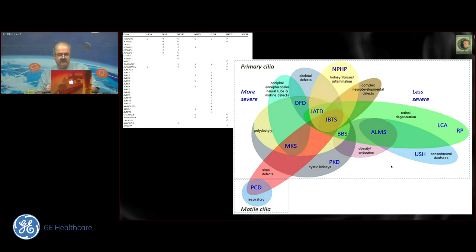Okay, a few more questions before we close. What does it mean, 28 weeks antenatal scan report given mild right hydronephrosis? Well, not enough. We must know what is the AP diameter and the rest of it. This is an incomplete report, obviously.